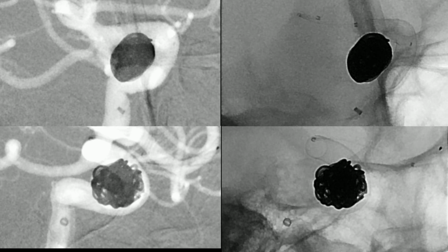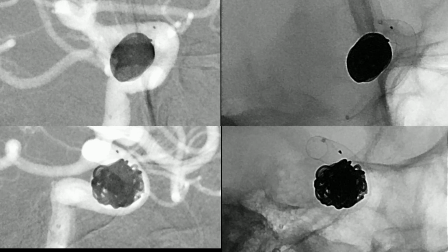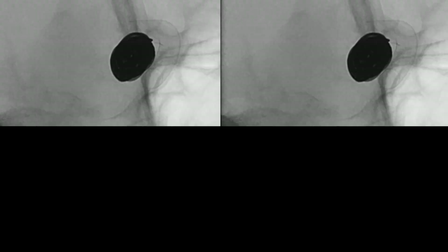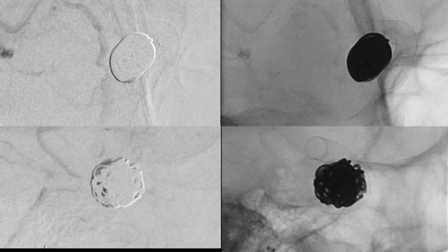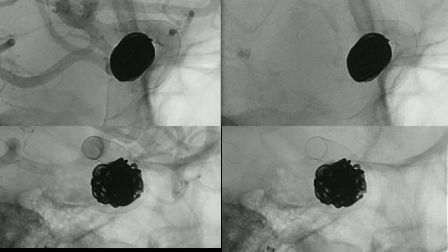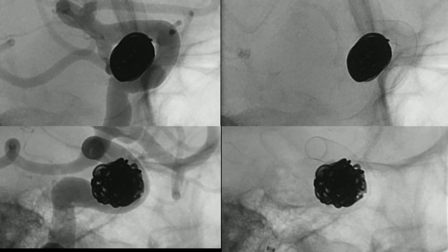And now we pull back the whole system carefully after reaching satisfying results and perform a 2D angiogram to see the end results of the intervention. And as you can see, there is a strong blood stasis in the aneurysm sac, and the flow diverter has opened well. And this is with the background. You can see that the wall apposition of the flow diverter is very good.